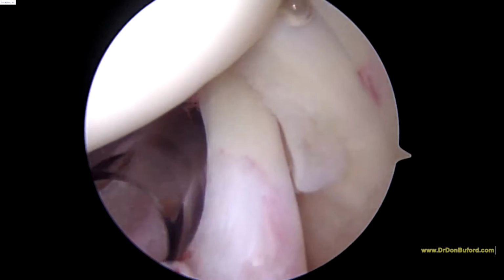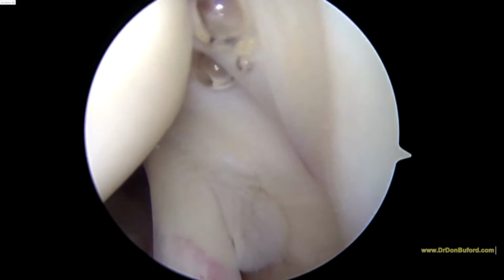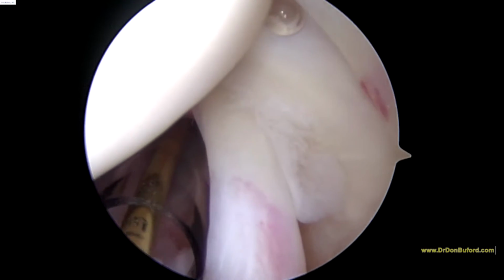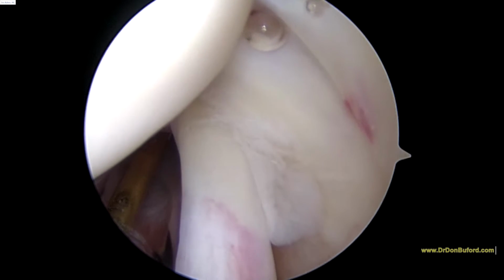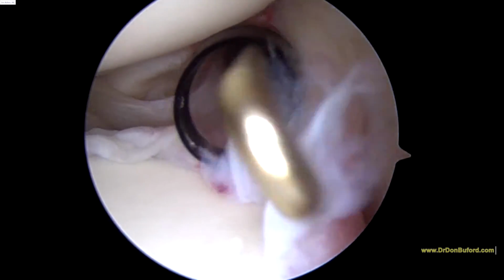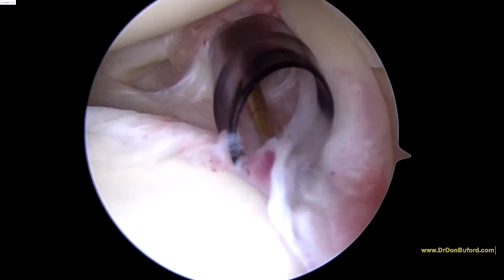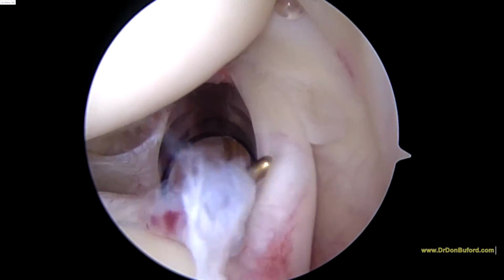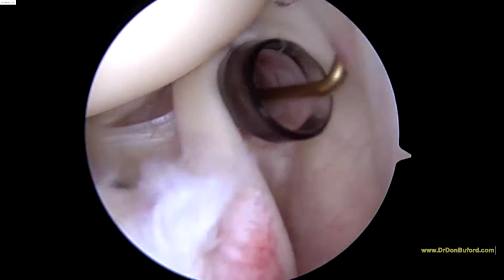Here's the tear in the biceps, so we are going to put a stitch in that just to secure it later. While we're getting the spinal needle and the relay ready to go, we'll probe it and show you why this is an issue. You can see the torn edge here, and we can see how this displaces. This is the biceps tendon running up here. Now you've got something on the back side here.